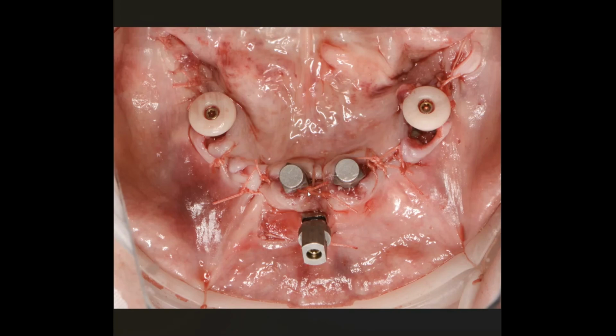go look at your CT scans, go look at your CBCTs, look at how deep it is. Ask yourself, if I were to puncture the buccal cortex 4 millimeters, 6 millimeters, is there a high likelihood of risk? I mean, some of the people that would say that are doing pterygoid implants, and you've got a much bigger bleeding risk in the posterior there in the pterygoid region, or even in the mandible for that matter.